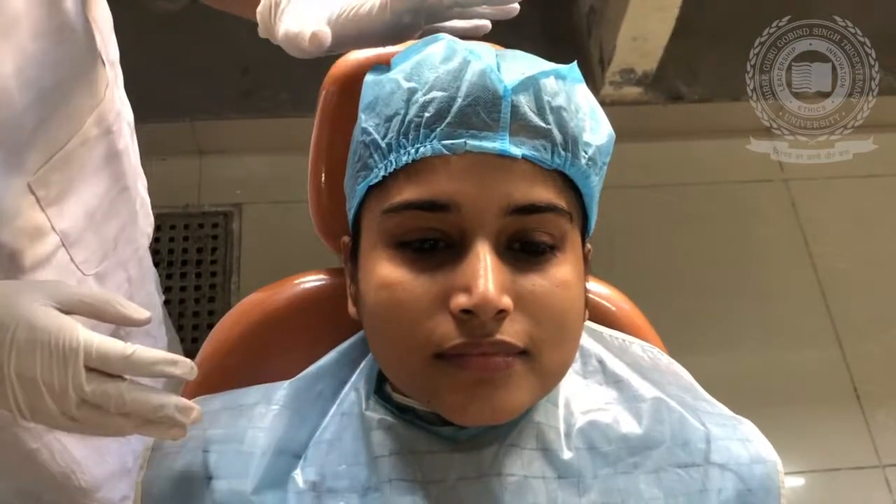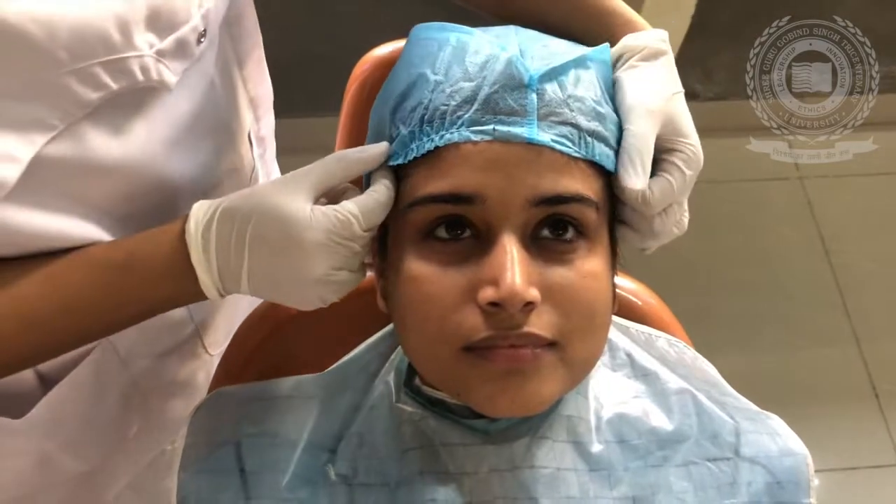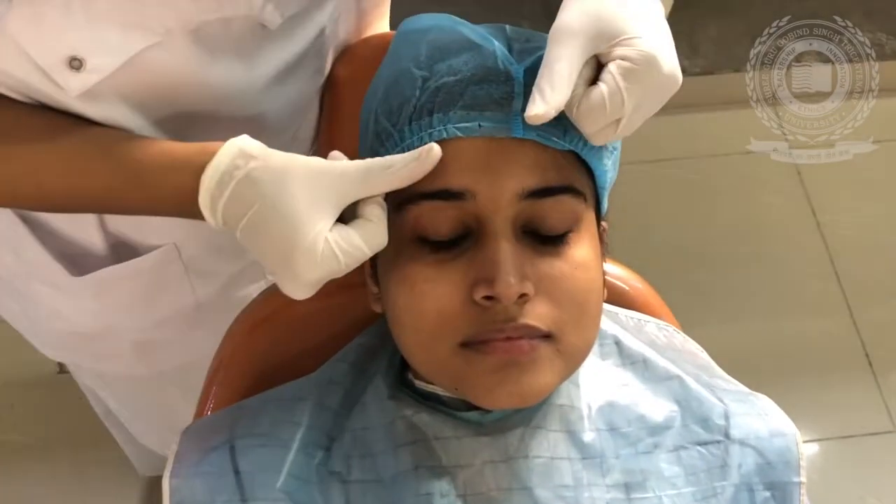Then, either we can place two straws into the nose, or we can leave the nose uncovered. In this case, we are going to leave the nose uncovered, so we are not placing any straw into the nose for breathing. What we will do is apply some Vaseline, especially in the area where there are hairs.